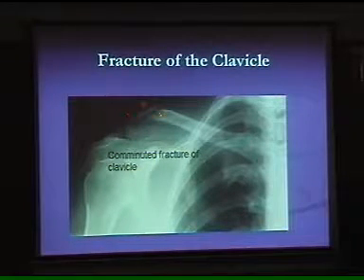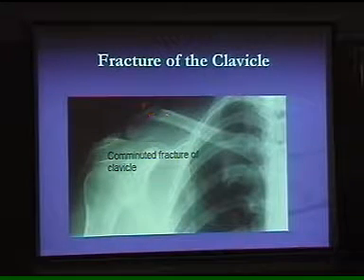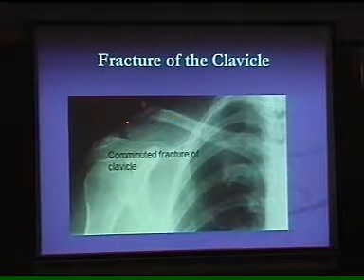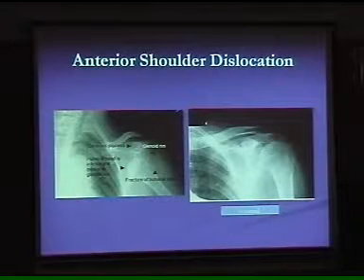But if you find an incidental finding, please X-ray both the clavicles and look for the primary. It will be a simple osteolytic lesion or metastatic lesion on one clavicle over here and maybe the opposite side here. Sometimes the picture is the same. The distal end is totally eaten up in that case.